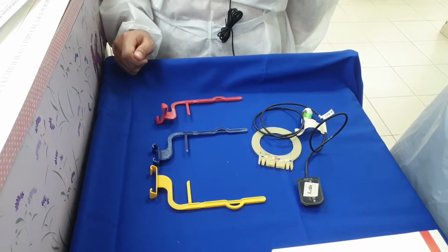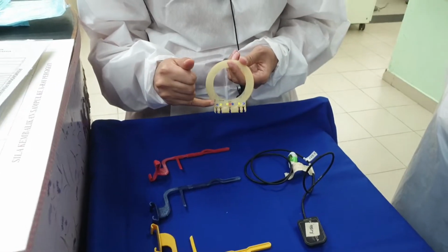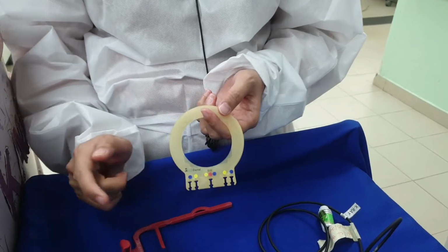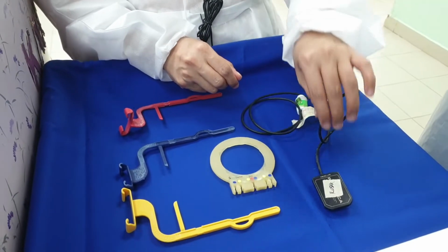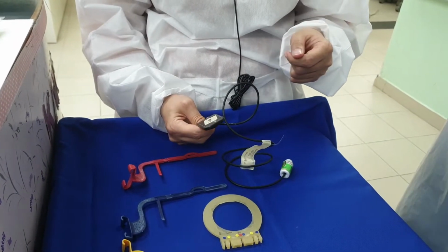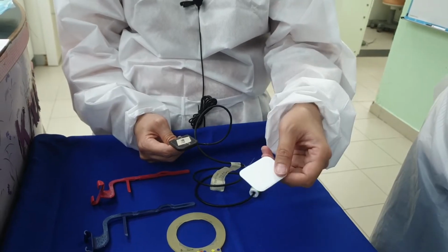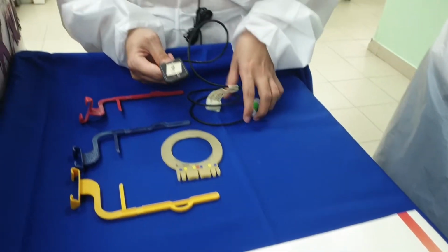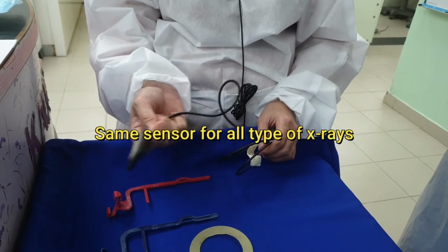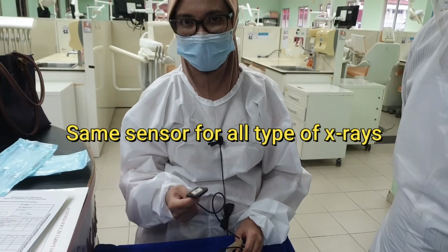One thing about digital X-ray, you will use the same locator ring, because the locator ring is color coded already for you to use according to the designated holder, and you will use the same digital sensor. Unlike the manual one, where you have to get a new film if you want to take a new X-ray, for digital X-ray you will use the same sensor for all types of image, whether it's Bitewing or periapical, anterior or posterior.